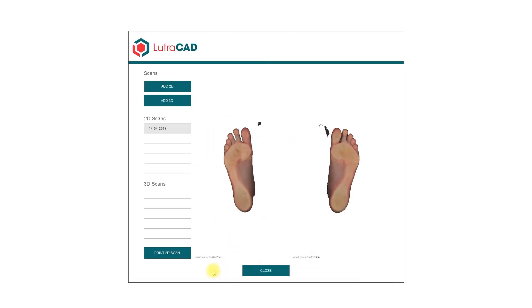The added scans can be found in the list on the left side of your screen, and the selected scans will be shown on the right side of your screen.